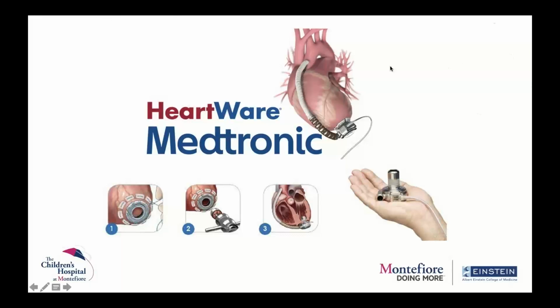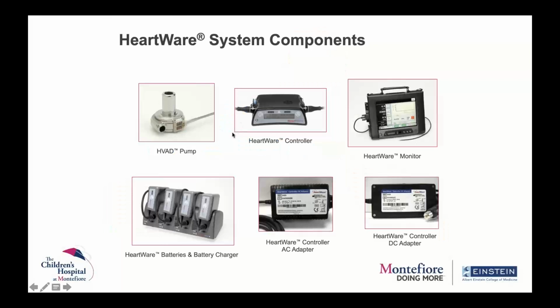It sits in there, and it only has this drive line, which is then connected to either an electrical circuit or batteries that comes out. And then you have this outflow graft that comes out and then connects to the aorta, and that then supplies blood to the body. It is a complex system. So you have the actual pump, then you have the controller, you have the monitor, you have the batteries, and then you have the adapters. So there are lots of components that go into this ventricular assist device.